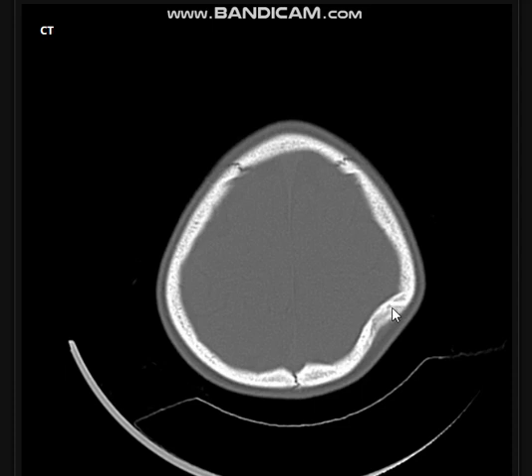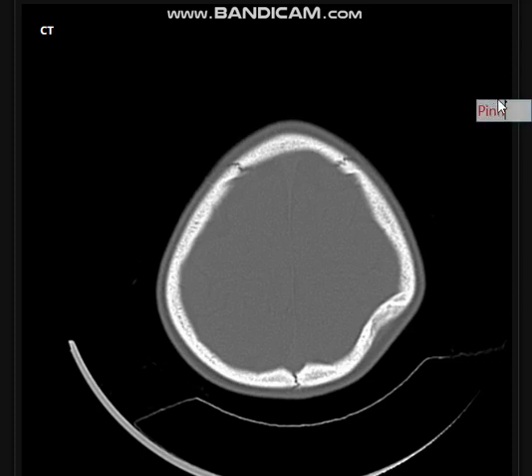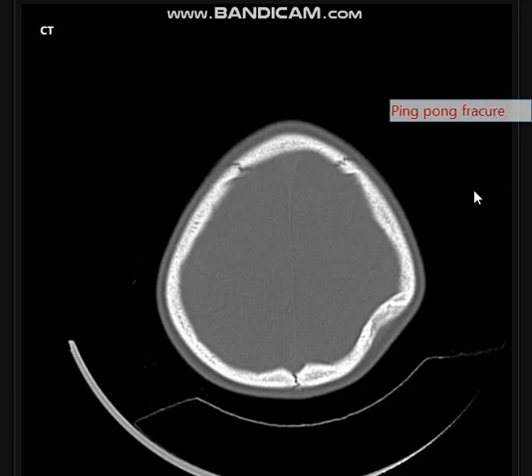As I always say, the bones of younger children are very malleable, so trauma might lead to just an indentation — leading to what we call a ping-pong fracture. I always describe this as very similar to a greenstick fracture, which occurs in the radius, ulna, or leg bones.